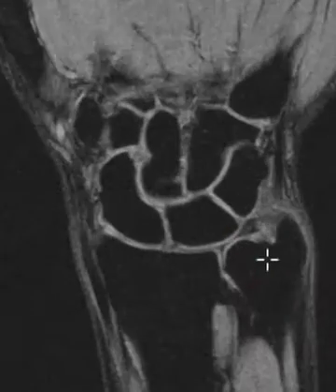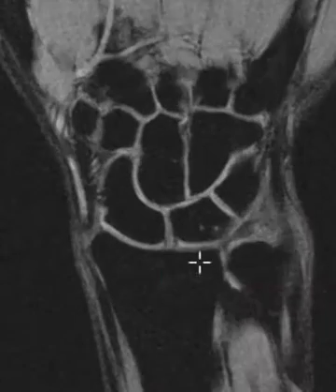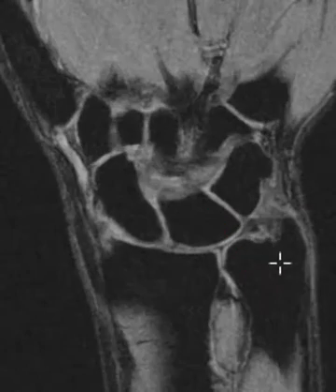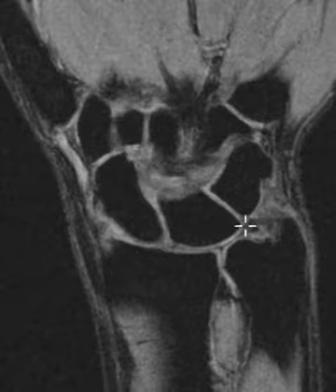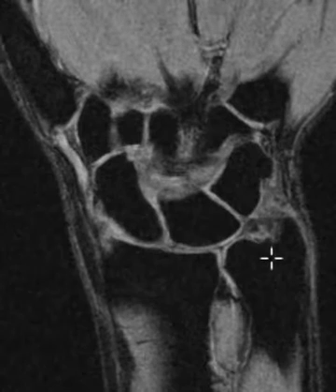Two findings: number one, scapholunate ligament tear; number two, positive ulnar variance and prominent thinning of the central disc. Over time this may lead to other problems. Thank you very much.